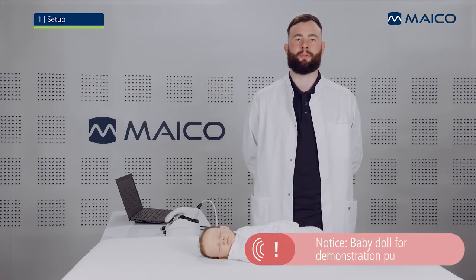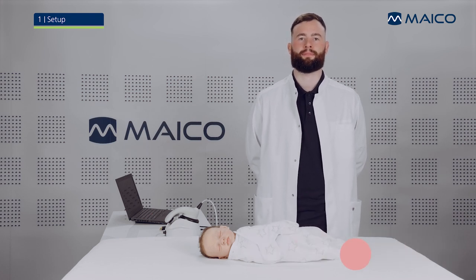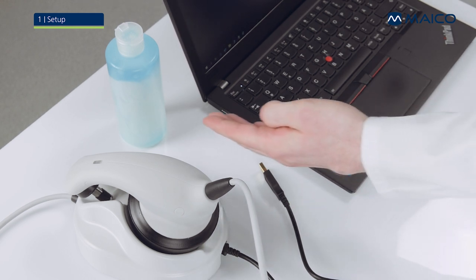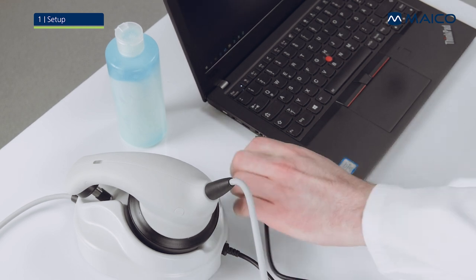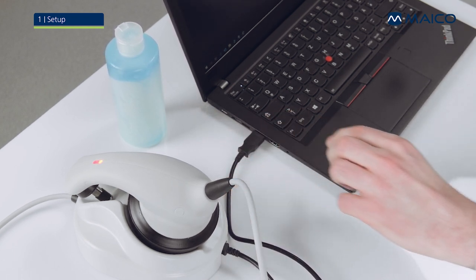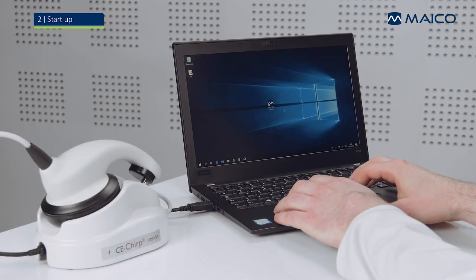This video will show you how to perform an ABR screening using the MAKO MB-11 Barafone. You will need the MB-11 Barafone, electrode gel, and a battery-driven laptop. Connect the MB-11 Barafone to your computer using the USB cable, then start the MB-11 software on your computer.